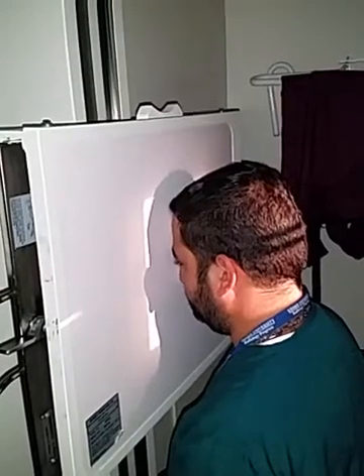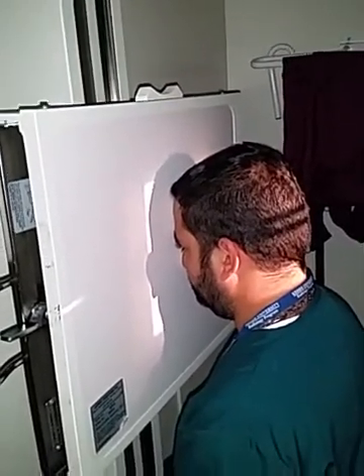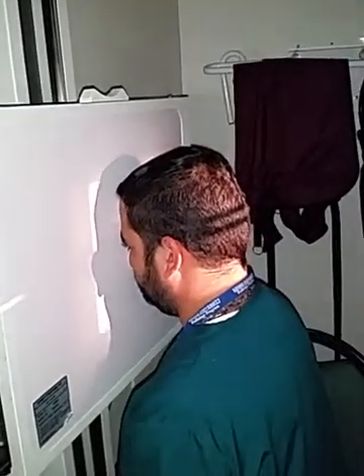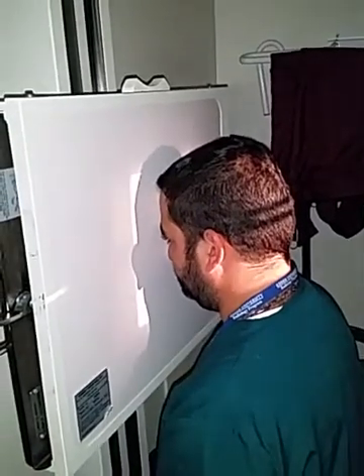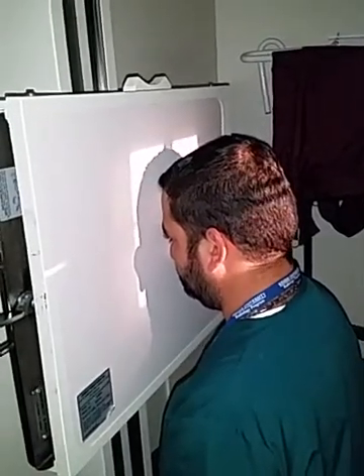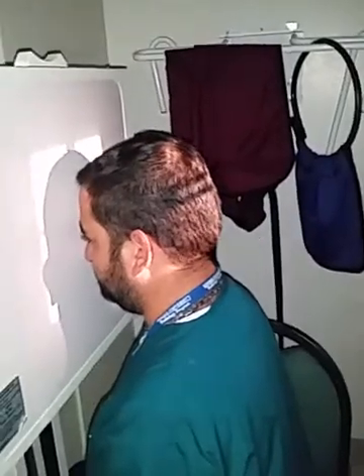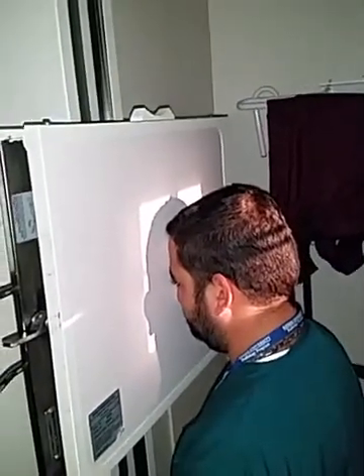I would look at that and I'd say, hey, you clipped the top of the cranium, why did you do that? And so what I want you guys to do is if I ask you, hey, where's the central ray? You're going to say the book says central rays exit the nasion. However, I cheated up to make sure that I wasn't clipping the top of his cranium. And then yes, go ahead, move the bucky up to correspond to your central ray. And that's the way that it should be.